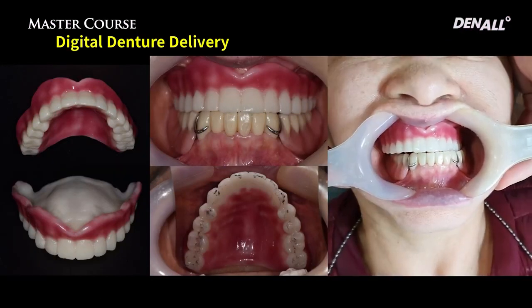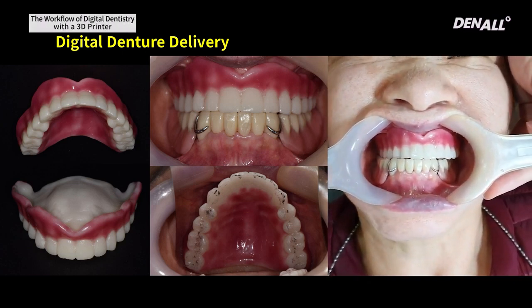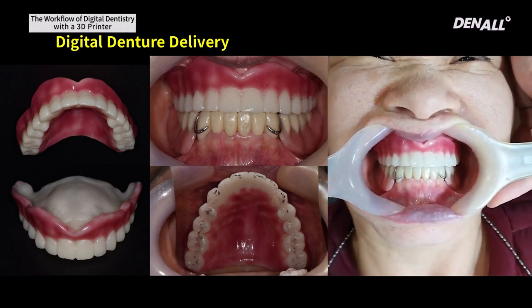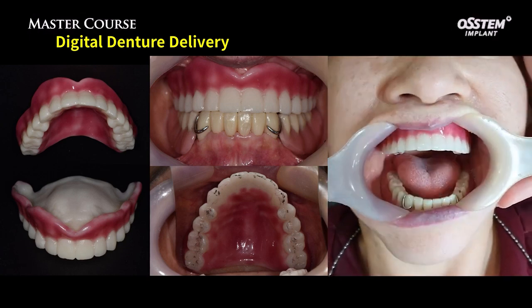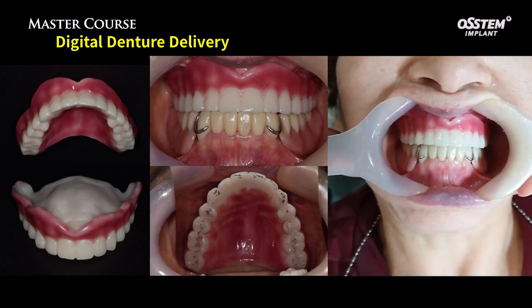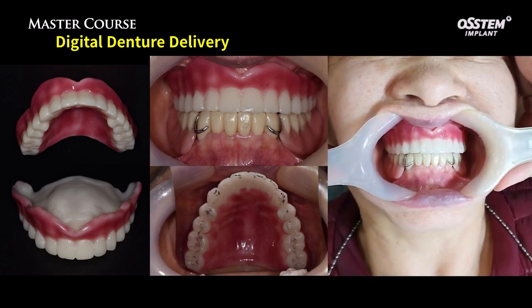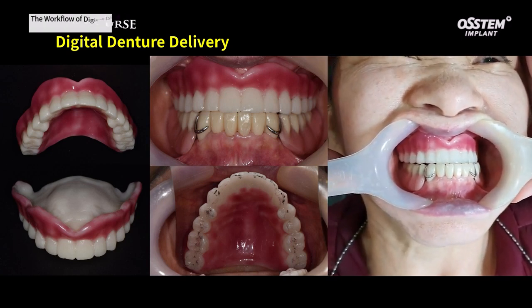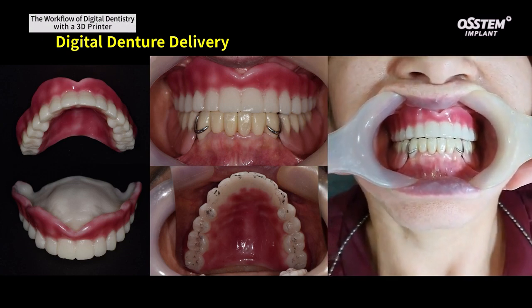After delivering to the patient, I am checking whether there are any functional issues. Compared to denture using flasking, when you use 3D printer, in my opinion, I think the biggest difference is that it fits better with the patient's tissue, so it does not fall off easily. Compared with the past, the patient is more satisfied because it does not fall off easily. Not just 3D printing, but milling machine can be used to fabricate denture. The fit for the patient is better if you mill denture rather than doing 3D printing.